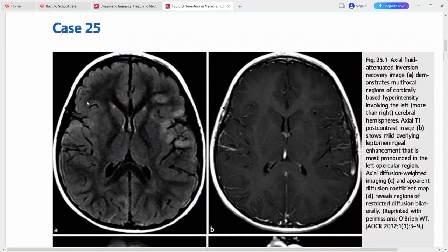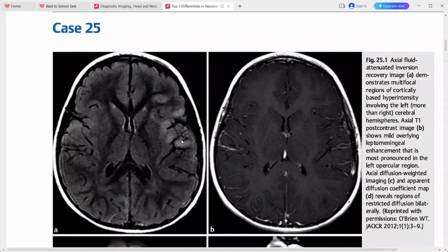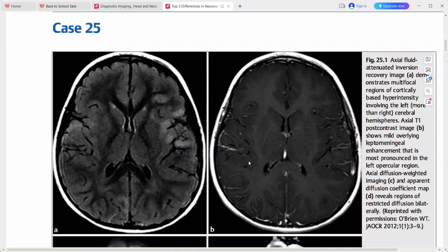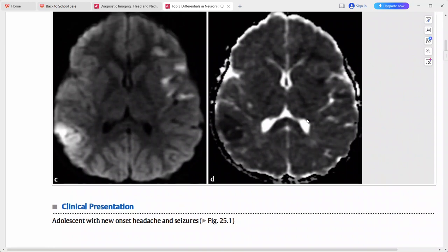There are several hyperintense areas here as well, so we can see that there are multifocal regions of cortically based hyperintensities predominantly involving the left hemisphere. The right hemisphere is also involved but most predominantly the left hemisphere, and there is mild leptomeningeal enhancement, most pronounced in the left opercular region.